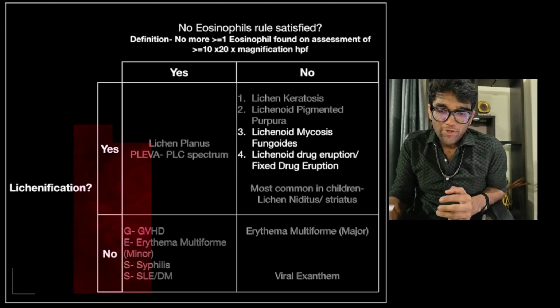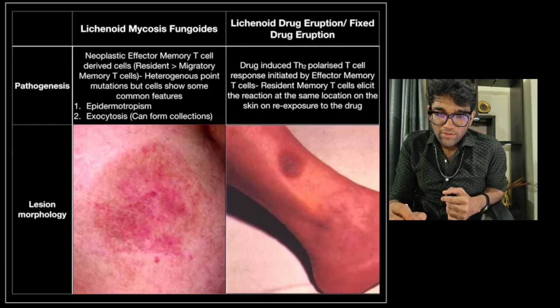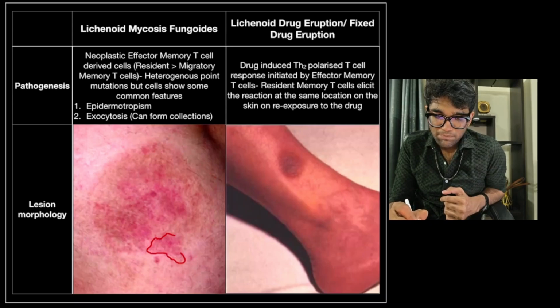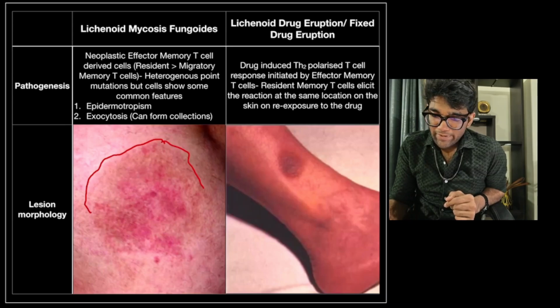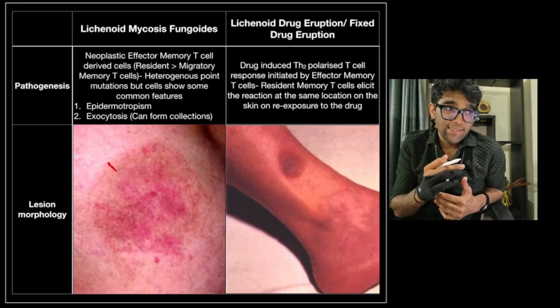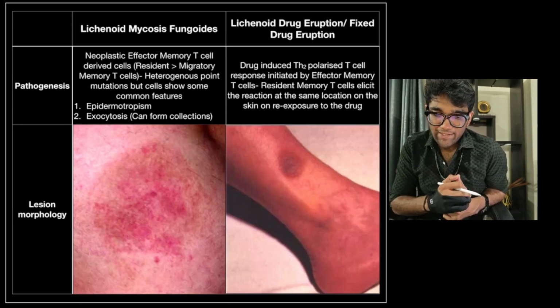So here I'm going to go slightly opposite. Okay, this is a repetitive example. So how would you describe this lesion? This is actually in parts relatively well demarcated. So this particular area of the lesion is well demarcated. Maybe you could say this area is also well demarcated, but parts of the lesion are definitely showing poor demarcation. Okay, there is a zone of transition where the lesion stops and where normal skin starts, you can't really tell. So there is a portion of the lesion that is not very clearly demarcated.